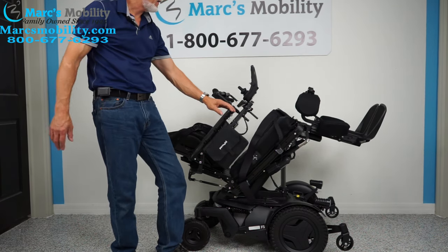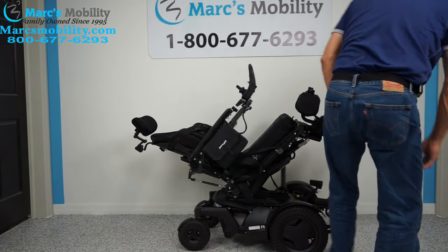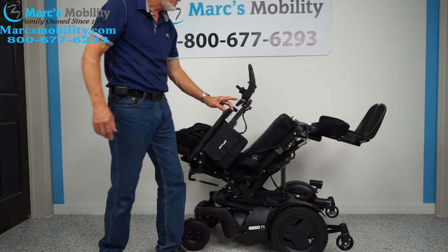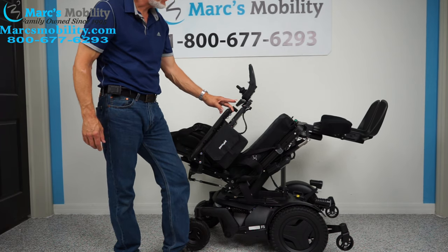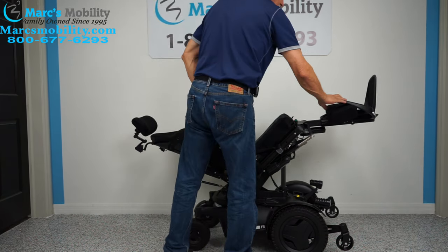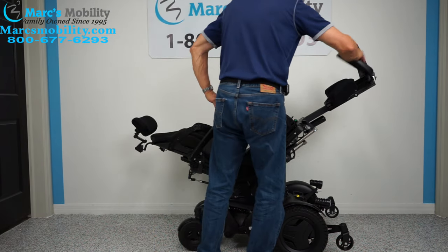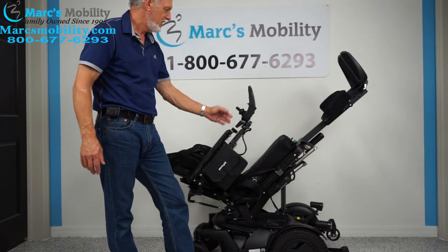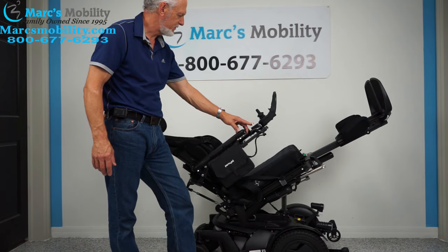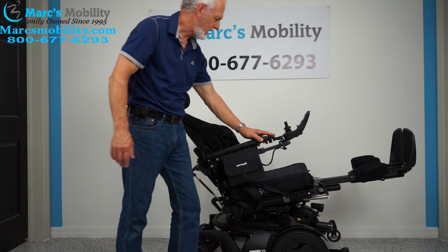We don't need the chest guard if we're not standing. I'm going to take the knee brace out and raise the legs. This chair has curved calf pads — they're great, but you can't lay the foot plate all the way flat because the calf pad is rounded. For good circulation, you can elevate the feet quite a bit, or halfway tilted so your feet are still higher than your body.